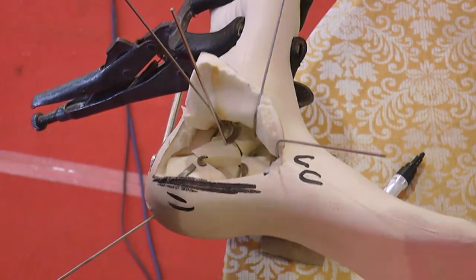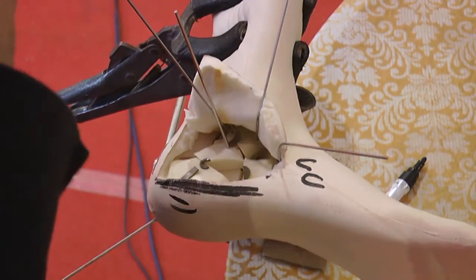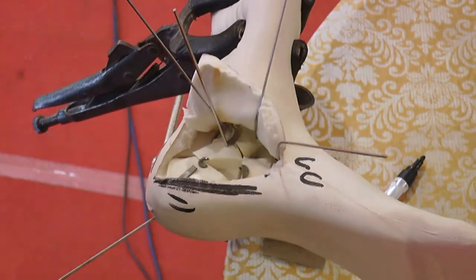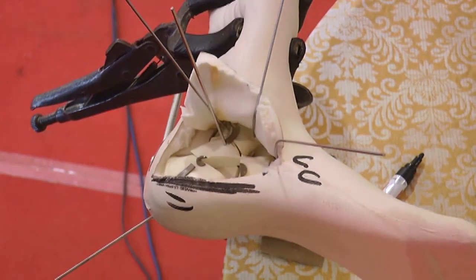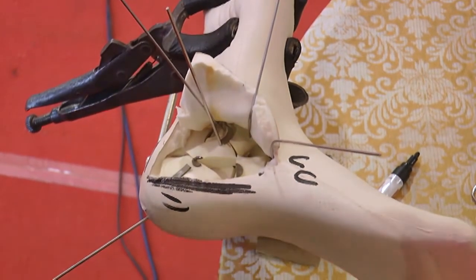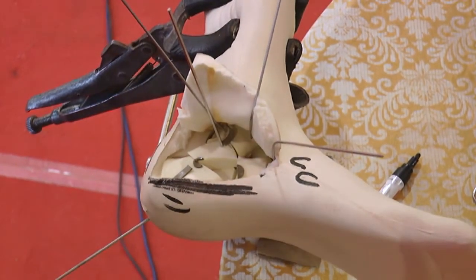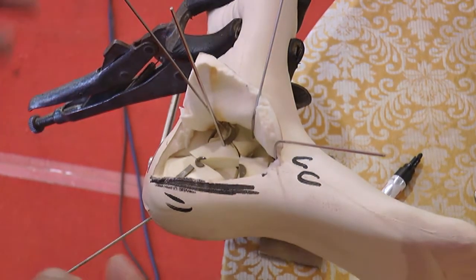The other way is obviously to do a C-arm, Broden views and lateral views and axial view. All three will show you the surface of the joint, and you can see that there is no step. If you are good at doing Broden view, you can very well see the fracture line and the joint surfaces. So the tuberosity reduced, medial wall reduced, the lateral facet has been lifted up and reduced.